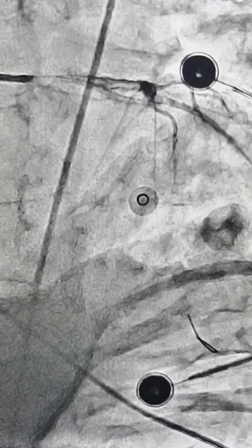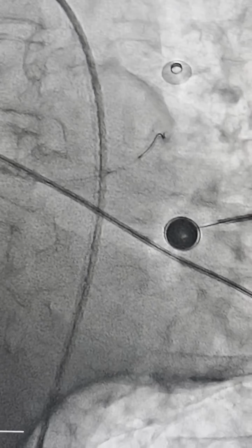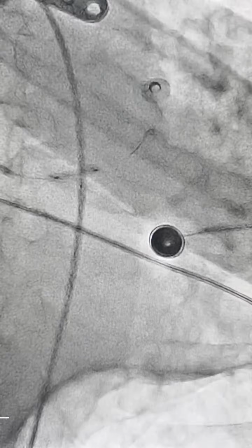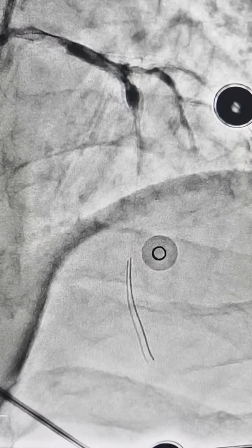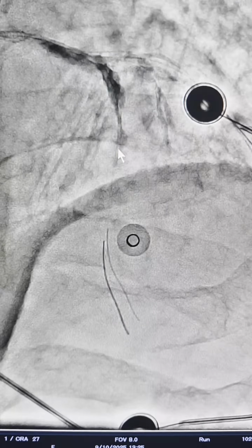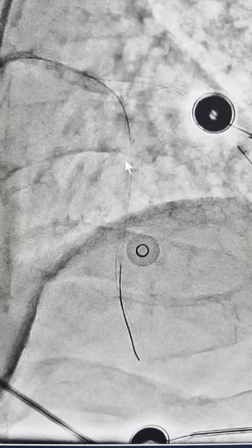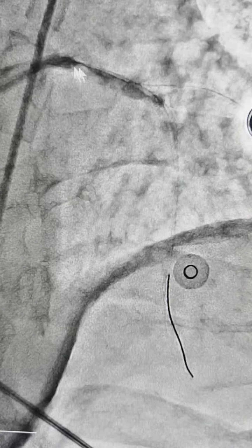So the CPR was going on, and so we put in the balloon. We ballooned it multiple times in various areas, first distally. We had not saved all the fluoros, I'm afraid. Then about this time the rhythm started coming back. He was on full-blown triple inotropic support, dopamine, dobutamine, norepinephrine, and his pressure... Then you can see that there was something wrong here.